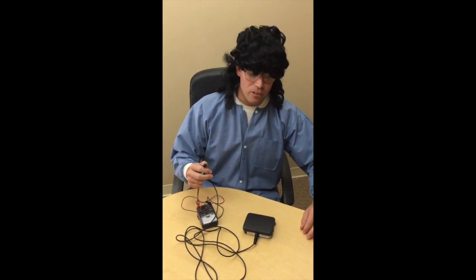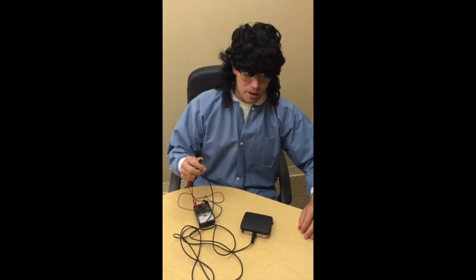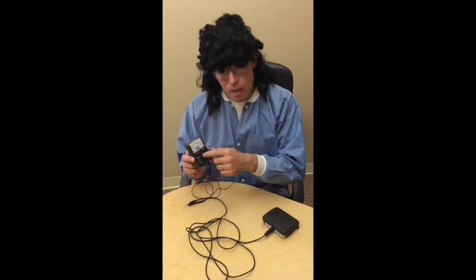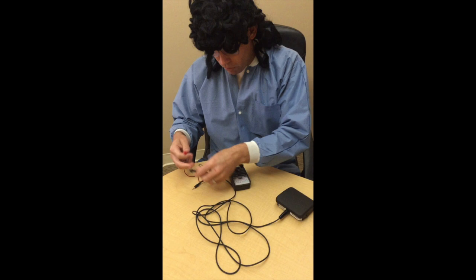First thing to check is the foot switch. We already checked to make sure that it's powered on. If it's powered on, you got to check the foot switch, because lots of times when you're moving this thing around on the floor, it breaks the cable right here. So we're going to use the voltmeter and put it on the continuity setting, then check and see whether the switch is working.